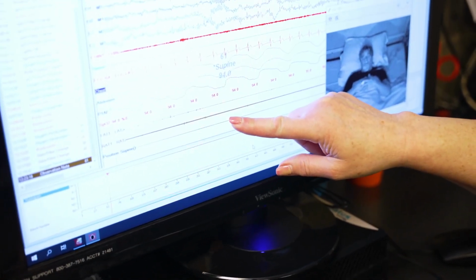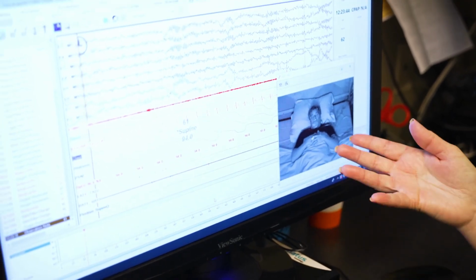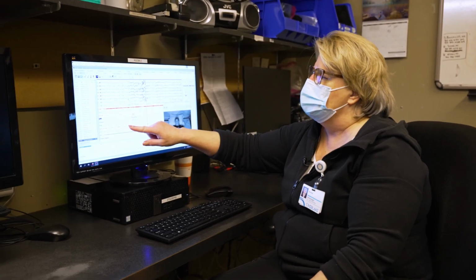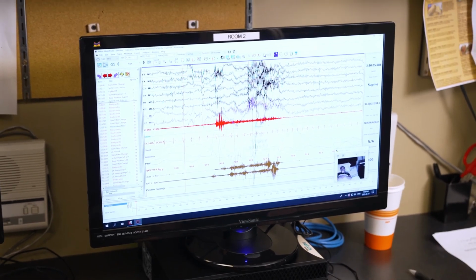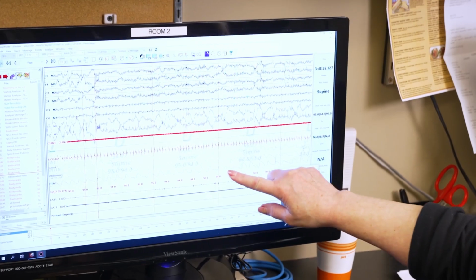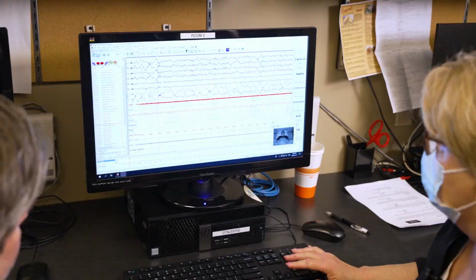You might have stumbled upon the widely adopted EDF data format when looking at time series, especially in the medical field. These files are a ubiquitous data format that has been used in various research projects like polysomnography studies since the early 2000s. You might be asking yourself, what exactly is this format? Why is there an EDF and an EDF Plus?